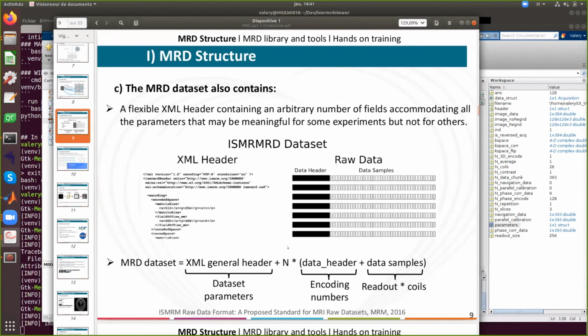And sometimes we also use the flags, which are in the data header, to look at the data which were calibration data, to identify them and to place them in or outside of the matrix. And that's why we used this architecture.